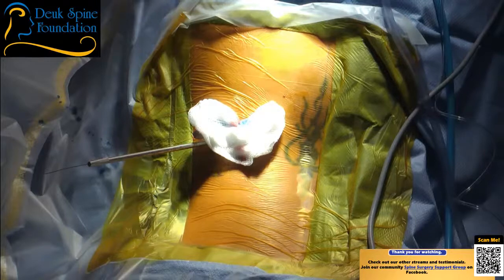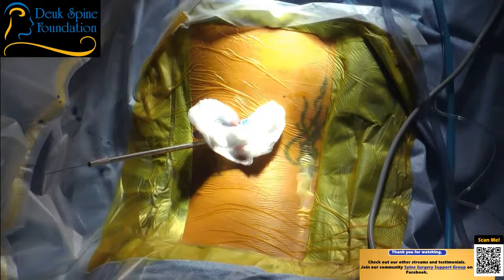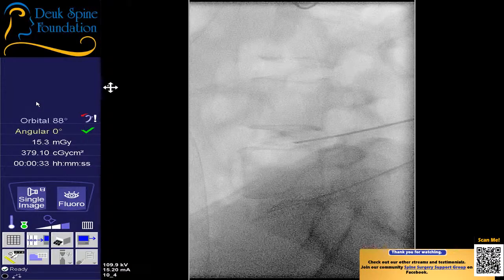So if you look at her x-ray, folks, this lateral view, Sean, I don't know if you can bring the x-ray up, but the pedicle of L5 is not as bad as the last case we did. Remember how short that guy's pedicle was? This patient actually has a longer pedicle at L5, so she doesn't really have the congenital stenosis we saw with the last case. She just has 2 damaged discs, and those discs are causing her back pain and intermittent pain down her right leg. You're doing great.